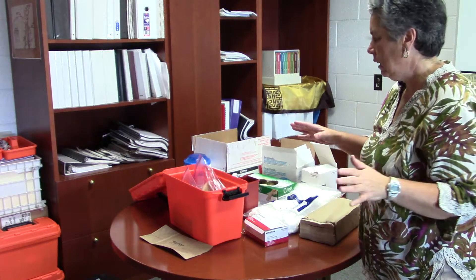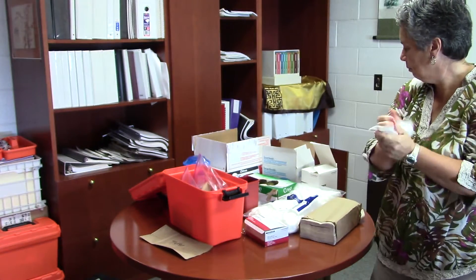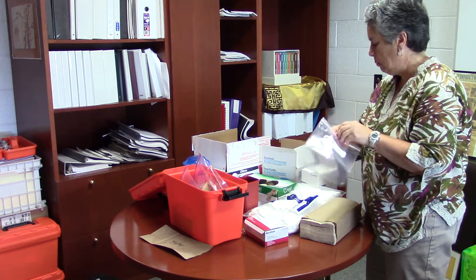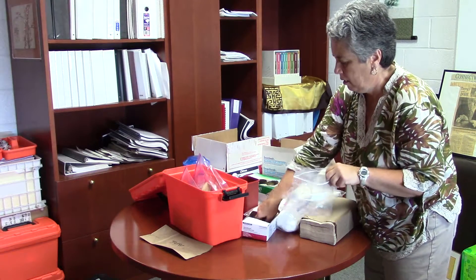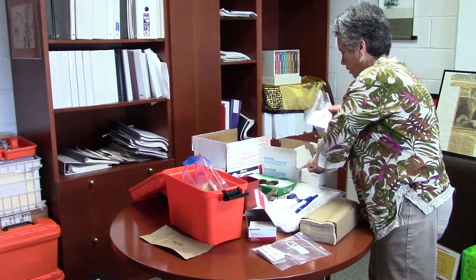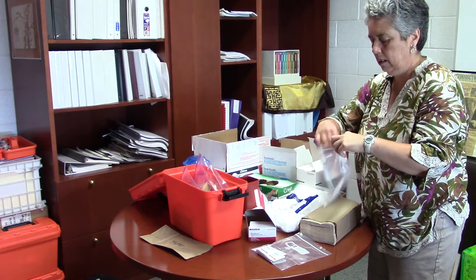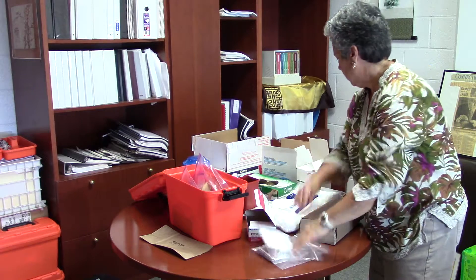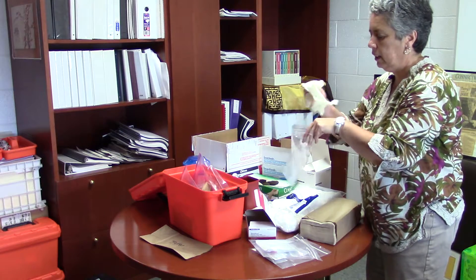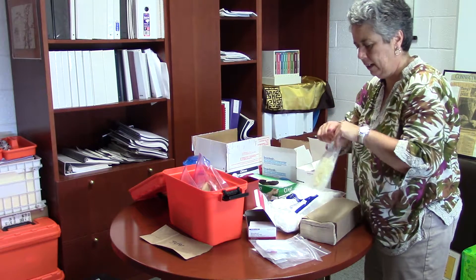Now I'm going to start doing my clean things, so I'm going to wash my hands again just to make sure my hands are clean when I touch things like cotton balls. This is where there are some differences — you have your choice. We're going to need six things in our clean bag. We need sufficient alcohol wipes — that's one. We need a couple of gauze, which you probably never use but they need to be in your bag anyway. You need gloves, at least two or three. These are clean, not sterile — they just come from your regular medical gloves bag. That's three.